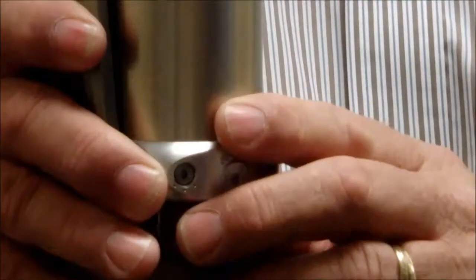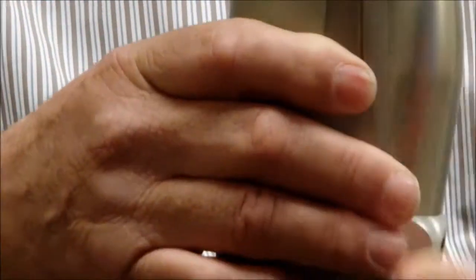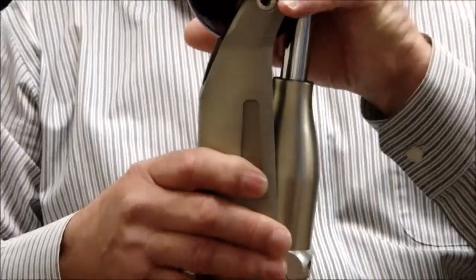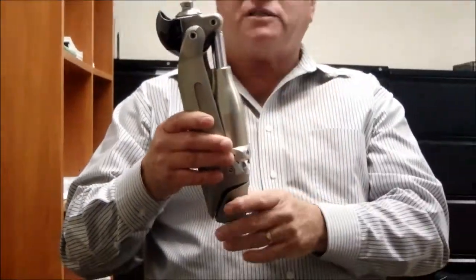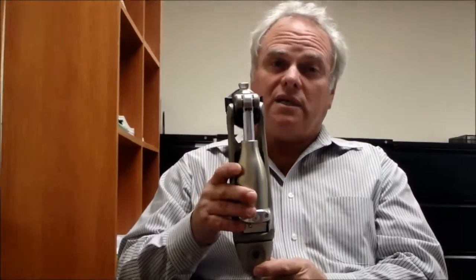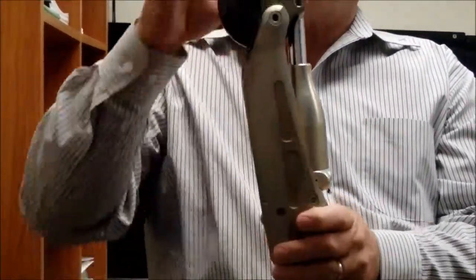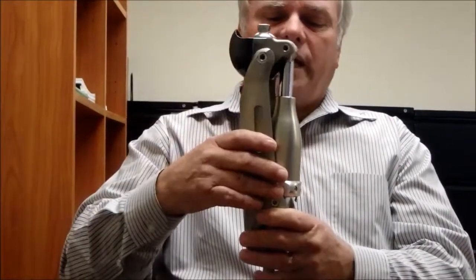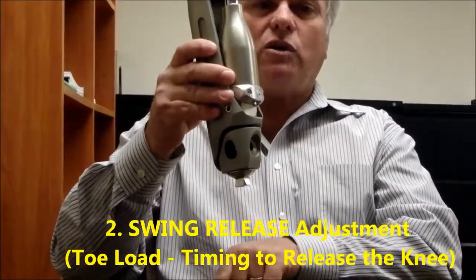Now once their stance is set and you've done the correct TKA bench alignment, this knee is ready to walk. The trick for walking is when does the knee release into swing? It needs a couple things to release into swing: one, full extension — the knee has to be fully extended — and two, they have to have a toe load.